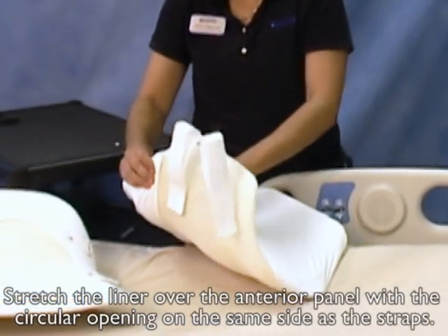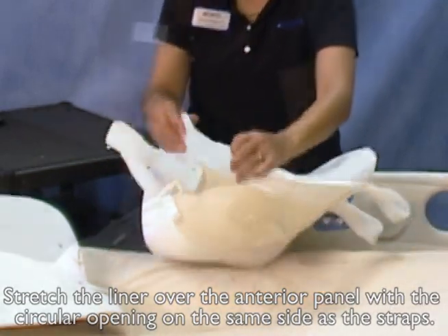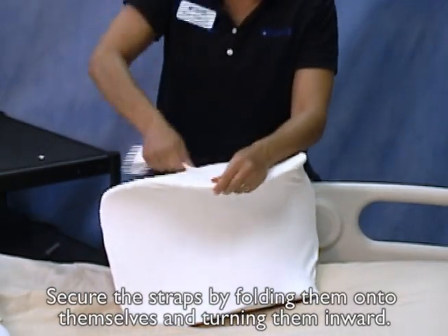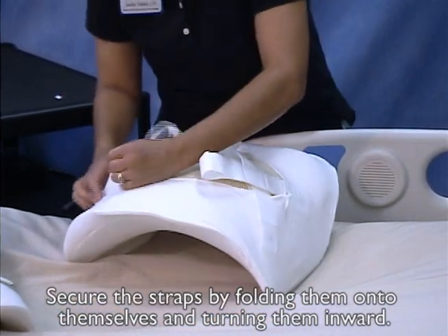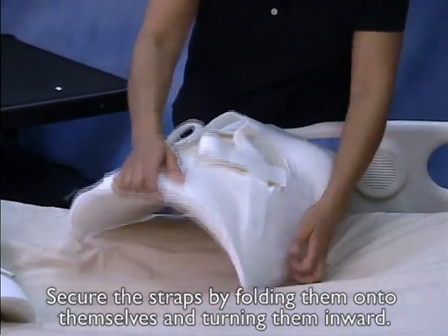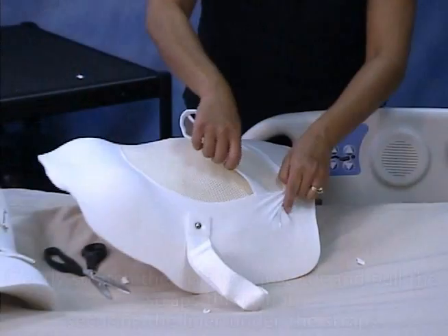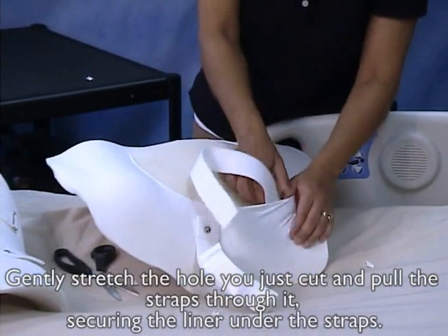Stretch the liner over the anterior panel with the circular opening on the same side as the straps. Secure the straps by folding them onto themselves and turning them inward. Pinch the liner to cut small holes just above the silver screws on the straps. Gently stretch the hole you just cut and pull the straps through it, securing the liner under the straps.